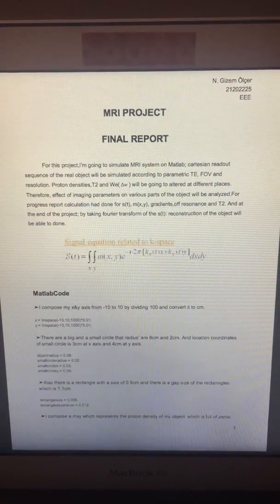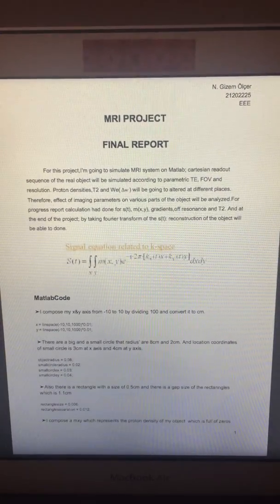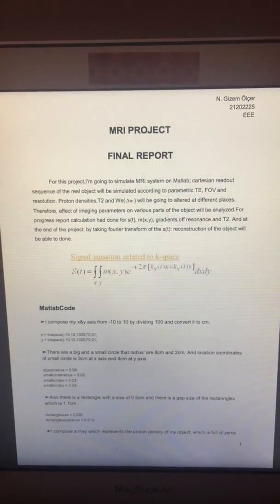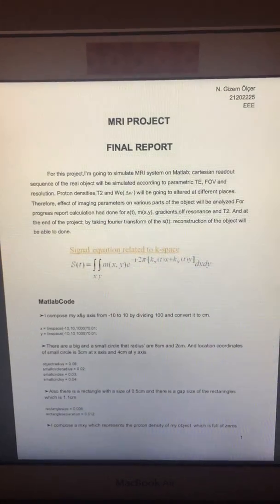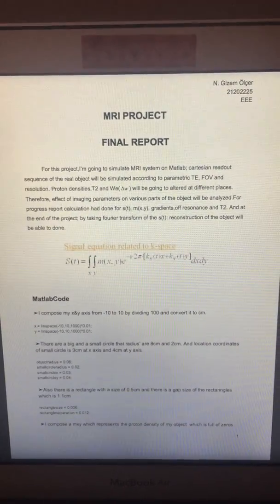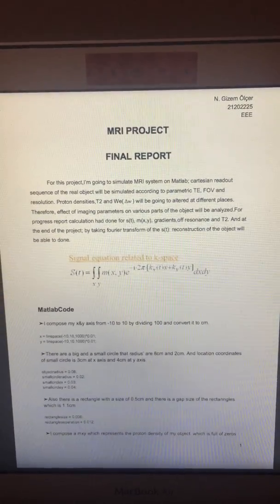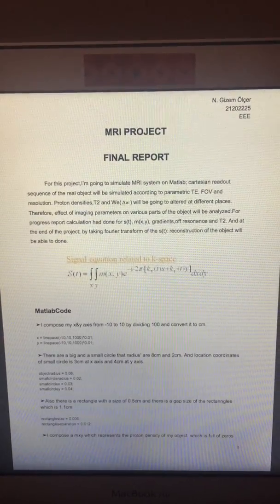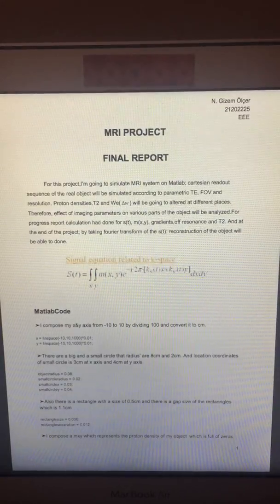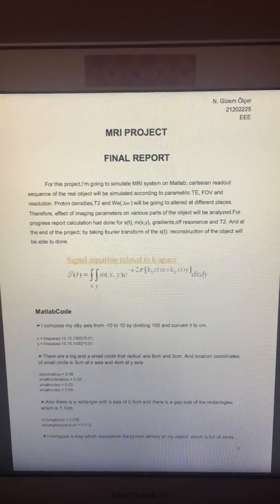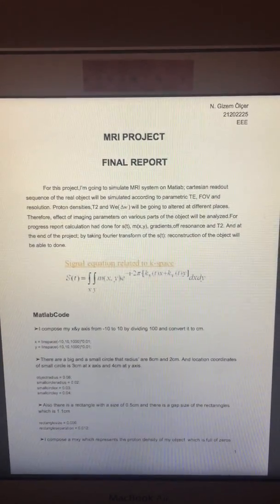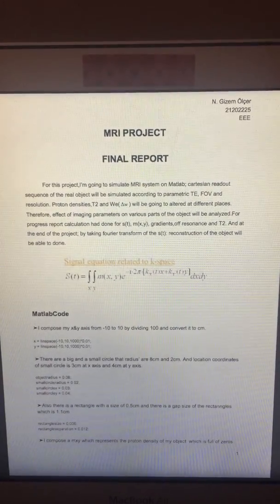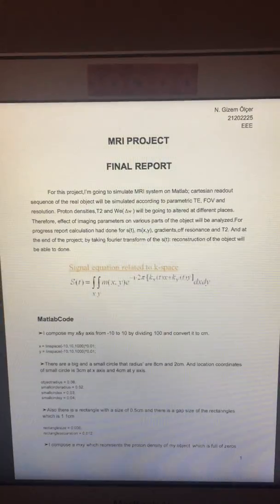Hi, I'm Gizem. This is my project for the Magnetic Resonance Imaging course. For this project, I'm going to simulate an MRI system on MATLAB. The Cartesian readout sequence of the real object will be simulated according to parametric TE, field of view, and resolution.